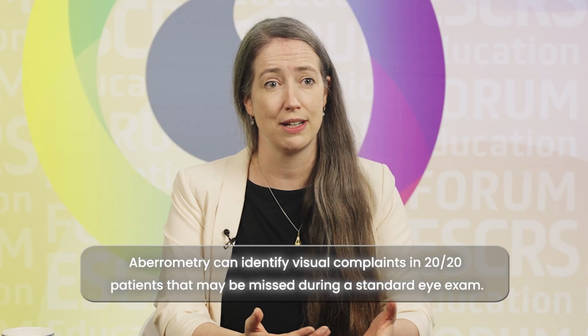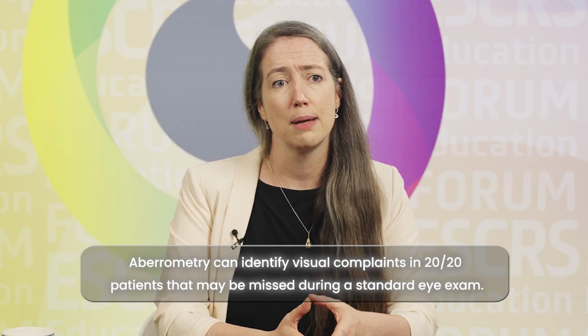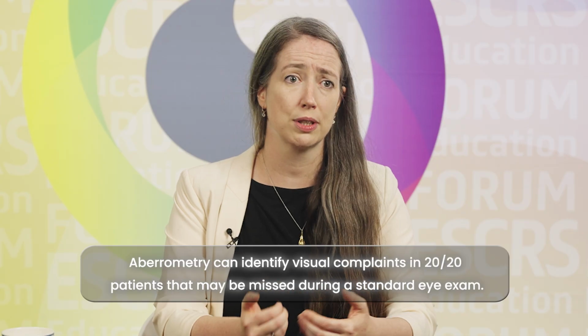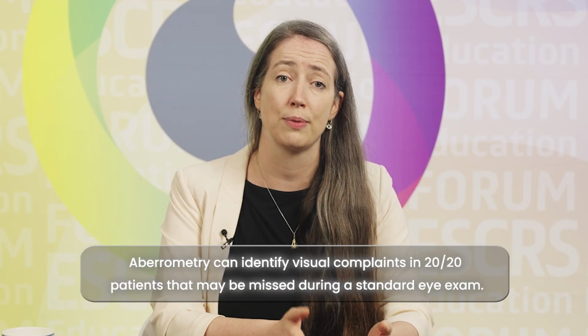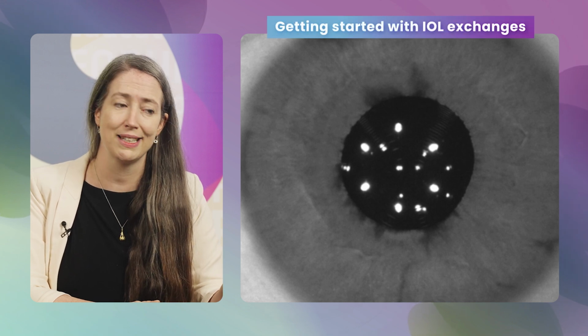But when I performed her aberrometry, which is a test I often do in these cases, patients who we call 20/20 unhappy are excellent cases to perform aberrometry on, because it can show you visual complaints that you can't see at the regular slit lamp. But on the infrared image on her aberrometry, we discovered something a little bit different.